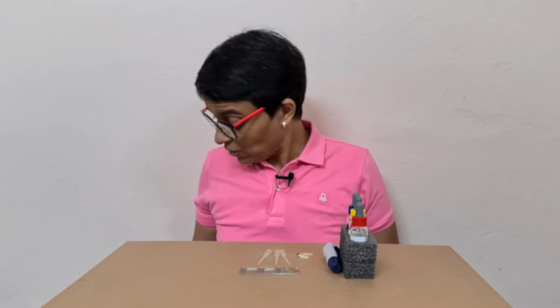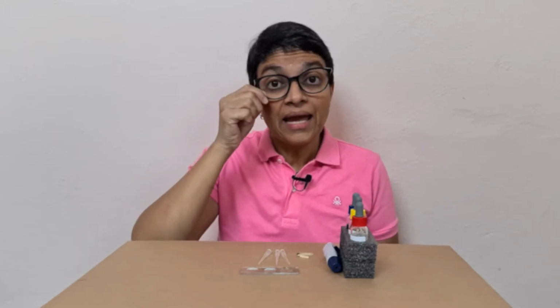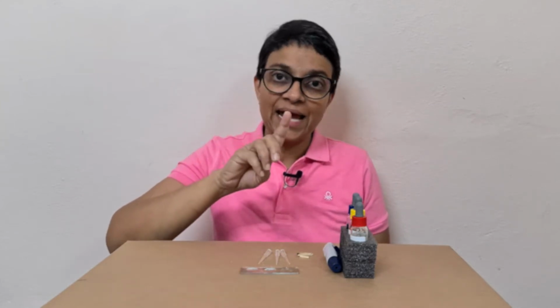So to perform the experiment, okay, I'll just tell you one more thing. A and B are codominant. That is, if a person has A allele plus B allele, he becomes AB blood group person. If he has only A antigen, he becomes A blood group.